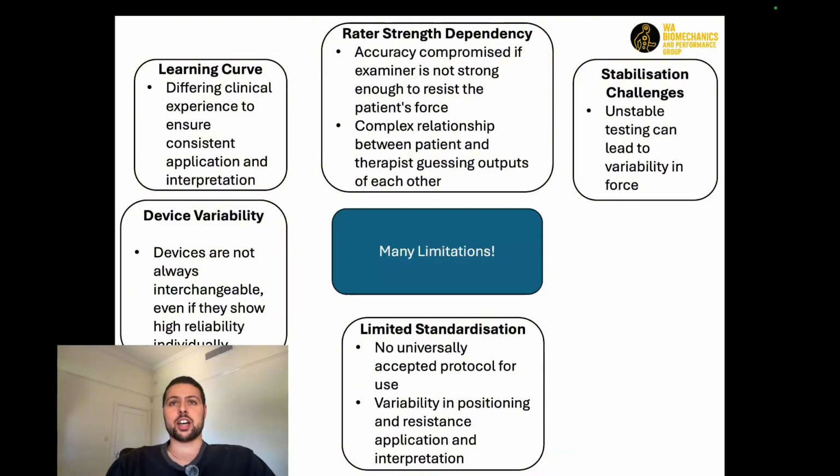I don't want to call out VALD, but some of their testing positions are influenced by balance. They're not really stating a bony landmark that needs to be used. It's very free flowing. There's some freehand work there, which is just not reliable.